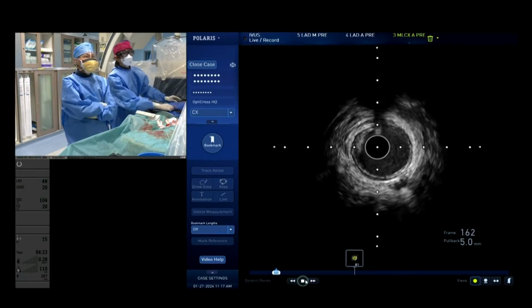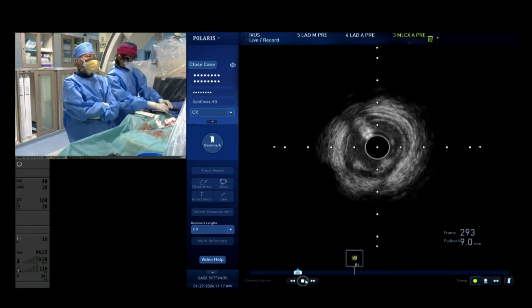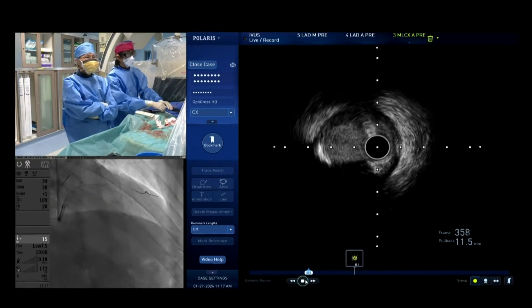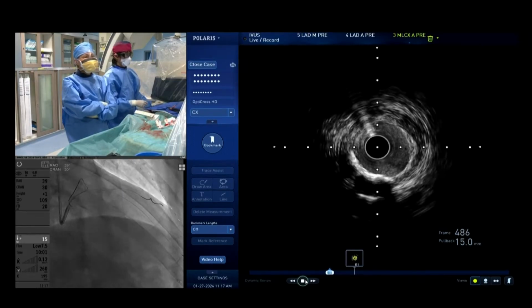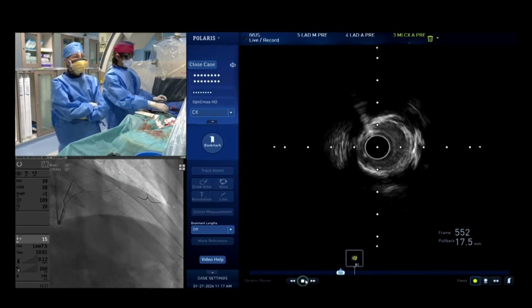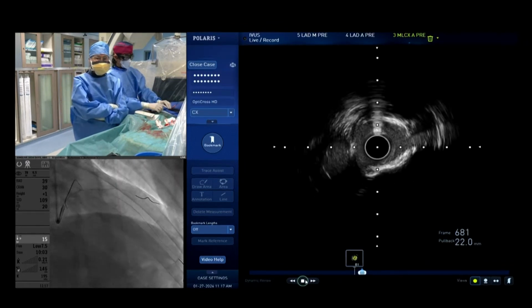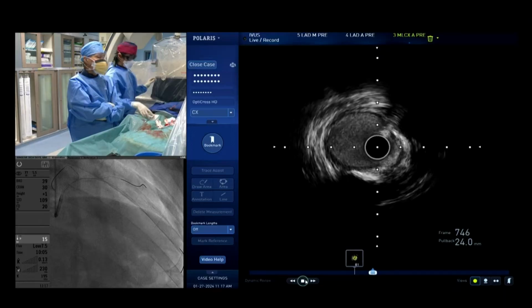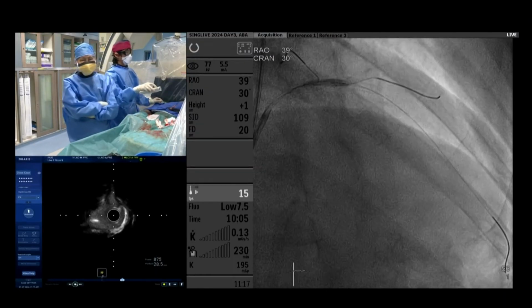I think we noticed that there was an area of waist in the balloon, so I guess there's no presence of calcified nodule in that area. No, it's just, I think, one or two quadrants of calcification at most. So because of that, we went ahead with the higher pressure balloon. Jonathan, you want to show that? Yeah, or bigger size rather.